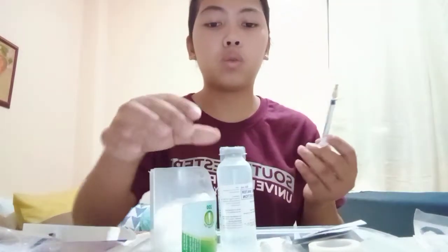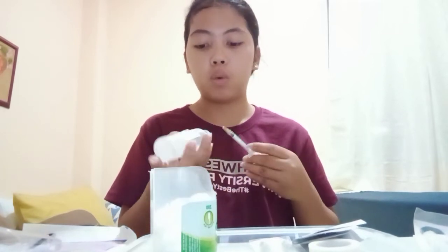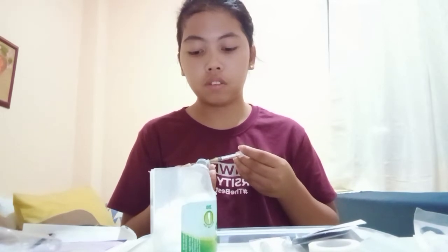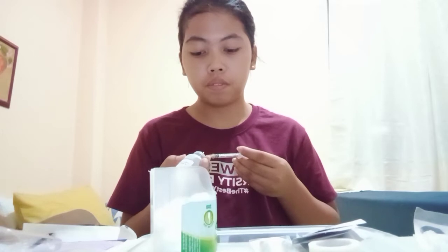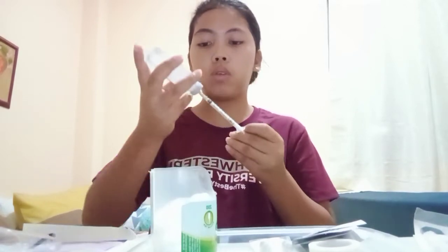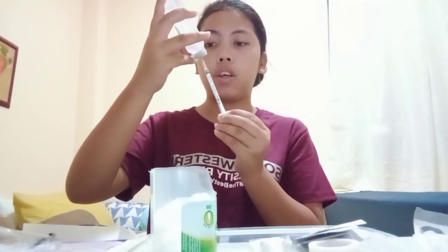The measurement that we will be needing for this skin test is approximately 0.1 ml. So we're going to insert the syringe, and then we're going to get the 0.1 ml.